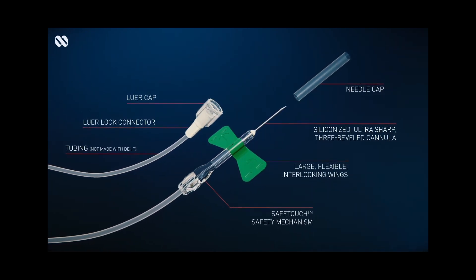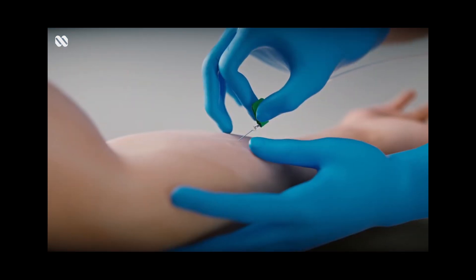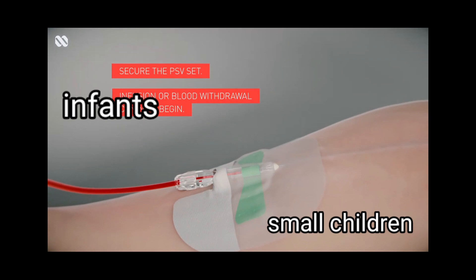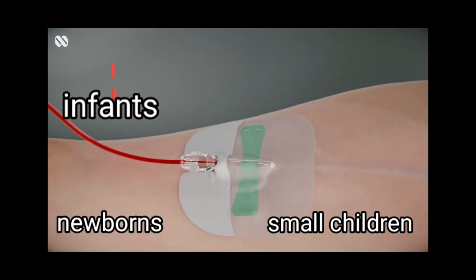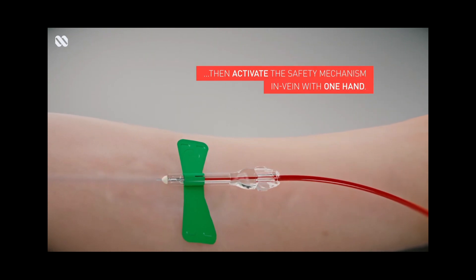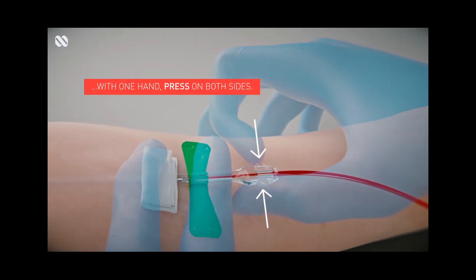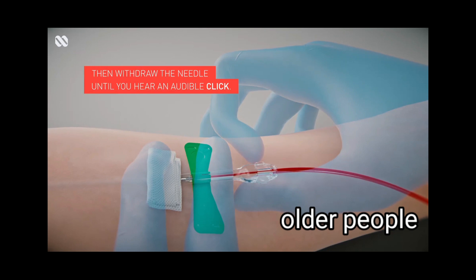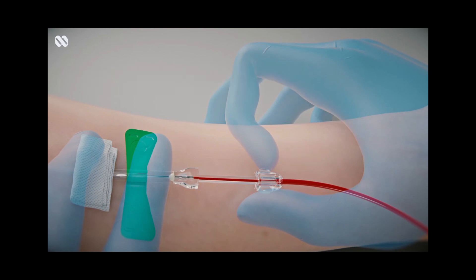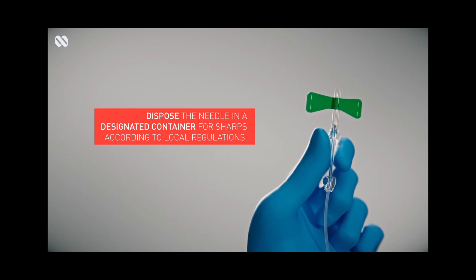Usually, a phlebotomist or a medical technologist may elect to use a winged infusion set or the butterfly when attempting to draw blood from antecubital veins of infants, small children, newborns, or from difficult adult veins such as small antecubital veins or wrist and hand veins from senior citizens, patients that have been in bed for a long period of time, so those bedridden patients, and edematous patients — those patients that have an abnormal accumulation of fluid in the different parts of the body.